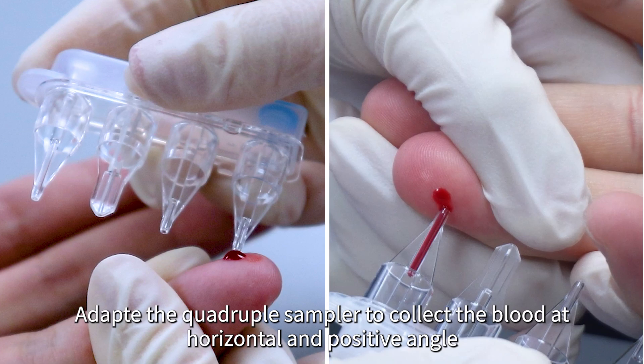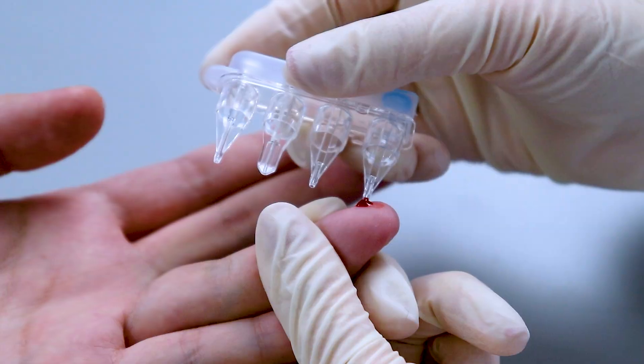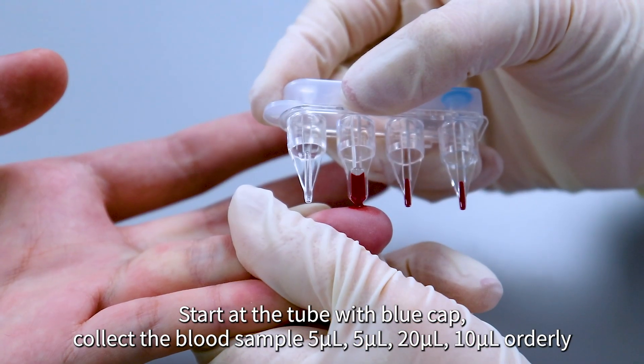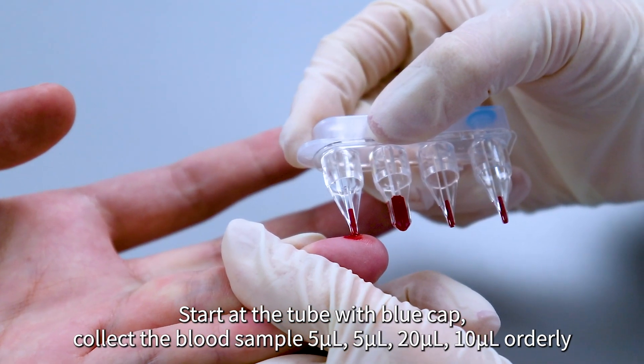Adapt the quadruple sampler to collect the blood at a horizontal and positive angle. Start at the tube with the blue cap. Collect the blood sample: 5 µL, 5 µL, 20 µL, and 10 µL orderly.